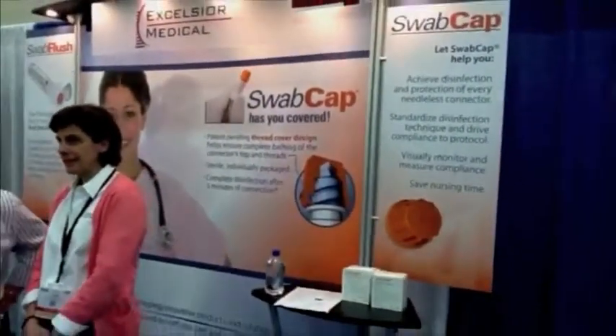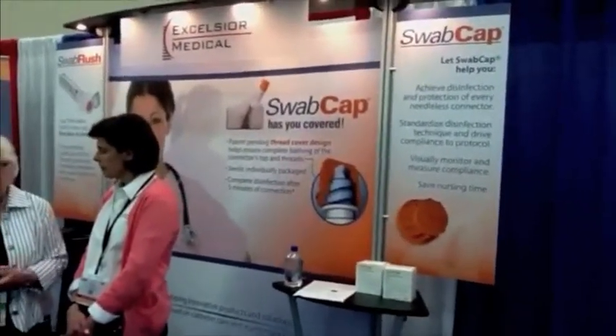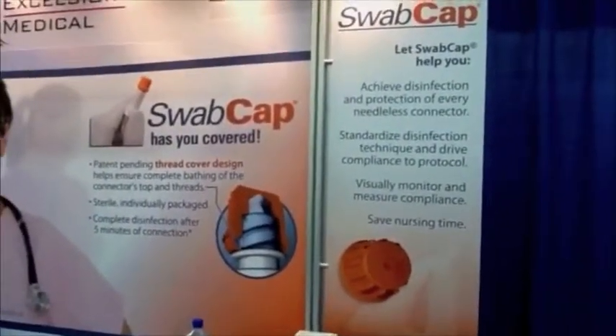This is Greg Dennis with Dowling and Dennis Public Relations, and we're here today at the annual meeting of the Infusion Nurses Society at the Excelsior Medical booth. Excelsior Medical makes Swab Cap, the disinfection cap for needleless connectors.